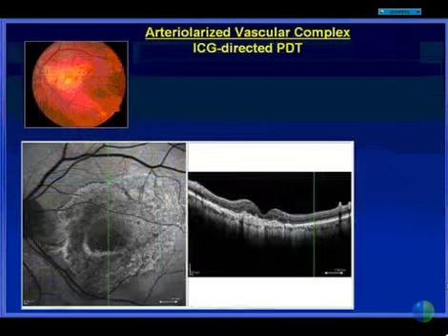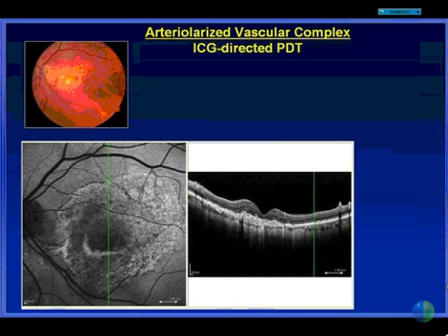we find that the autofluorescence function on the Spectralis is very useful in helping us predict visual recovery. What this case showed with autofluorescence was, in fact, that there was loss of the central autofluorescence, explaining RPE atrophy and the patient's poor central vision. But one might expect bare count fingers vision for a lesion that involved the entire posterior pole. In this case, the residual autofluorescence was relatively intact.